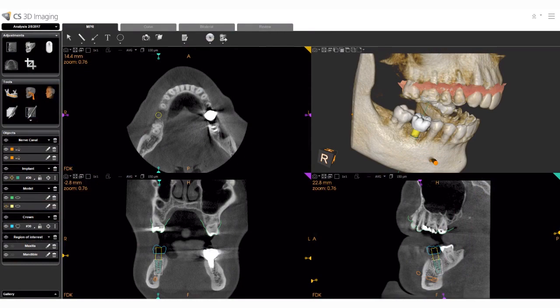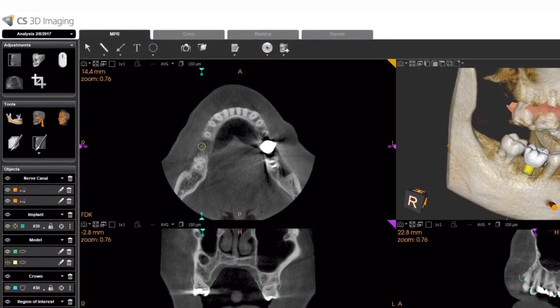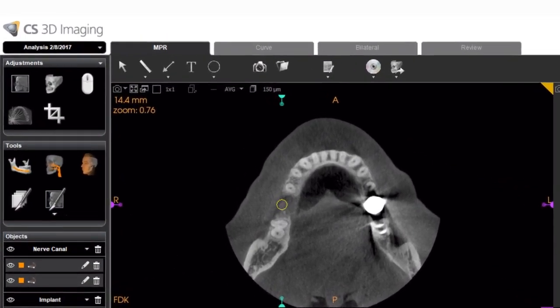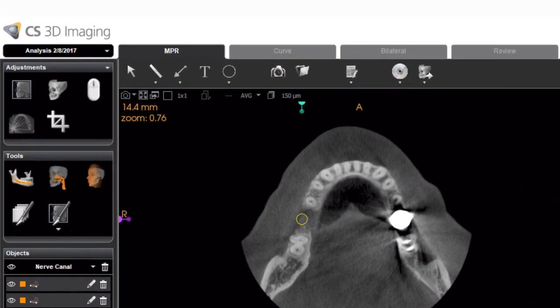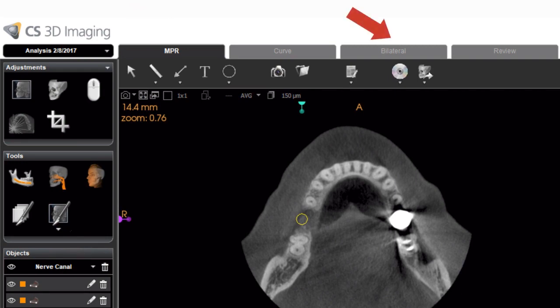The simplified user interface now has four tabs. The orthogonal and oblique tabs have been merged into a single MPR tab. The customized tab has been renamed to bilateral.